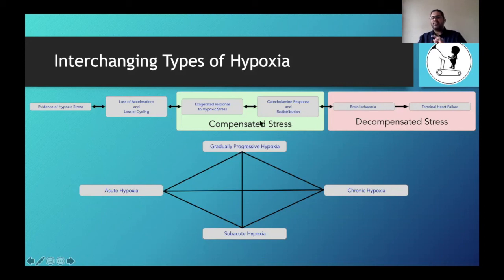That's why I said if subacute hypoxia is getting worse, the first thing that you're going to notice is that the variability is going to go off. Baseline is not necessarily going to go up. And once you reverse the subacute hypoxia, it will actually start from this step, which means it jumped a step. Does that make sense? So be very, very cautious because they do interact. Any questions?